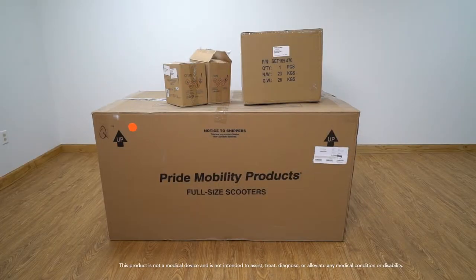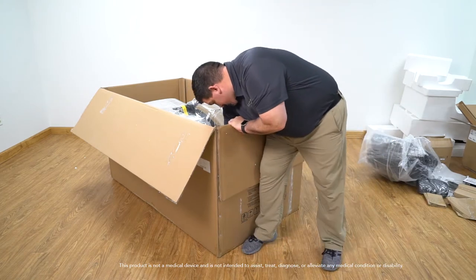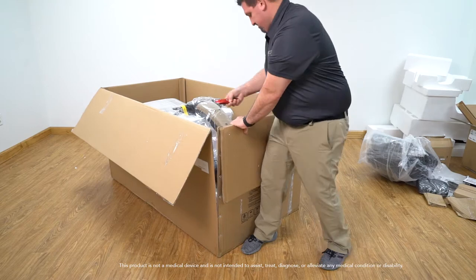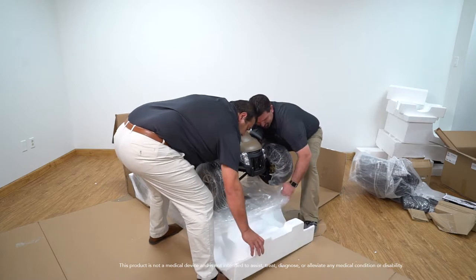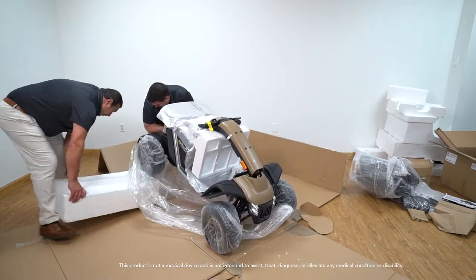The Wrangler will be shipped in four separate boxes: the Wrangler, the Wrangler's seat, and the batteries. The best way to open and remove the Wrangler from its box is to cut both the front and the rear of the box and collapse all sides. Pride recommends that you have two people to remove the Wrangler from the box. Once removed, one person can assemble the unit.